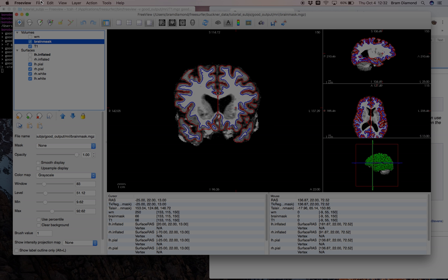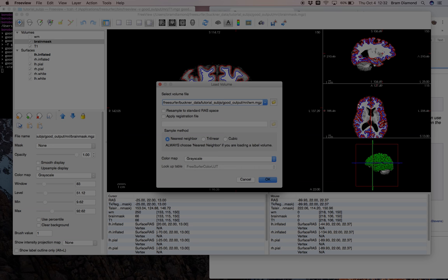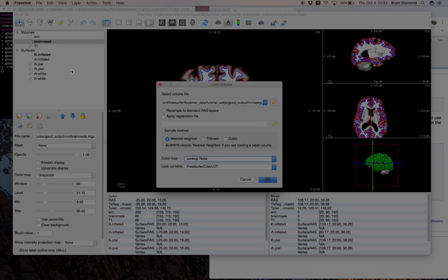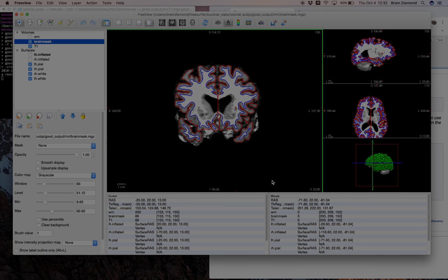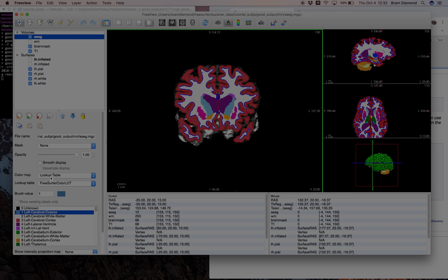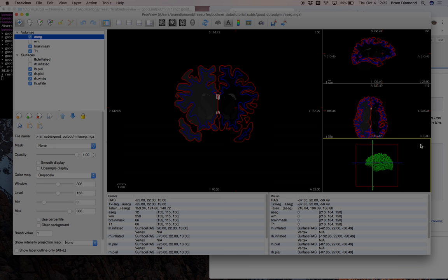Now we're going to load a volume called the ASEG, which stands for automatic segmentation — a subcortical segmentation of the brain. We'll open it with a lookup table color map rather than grayscale. The ASEG is loaded with a lookup table as the color map; if we were to look at it with grayscale, it wouldn't really make much sense.